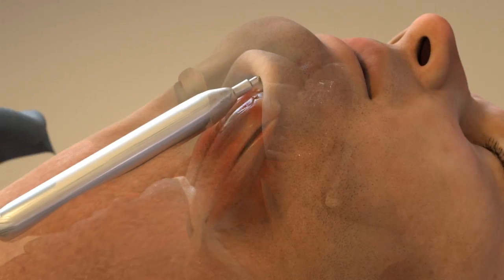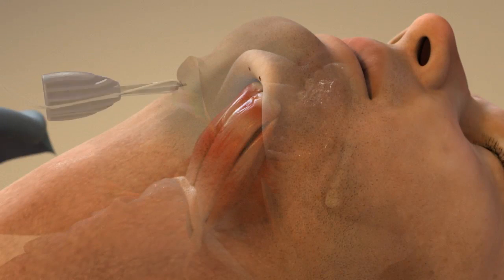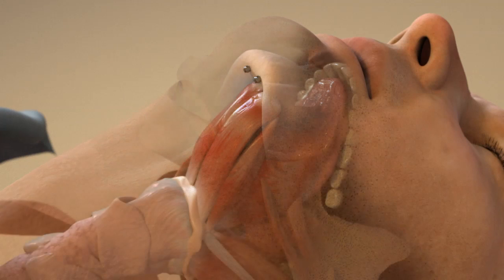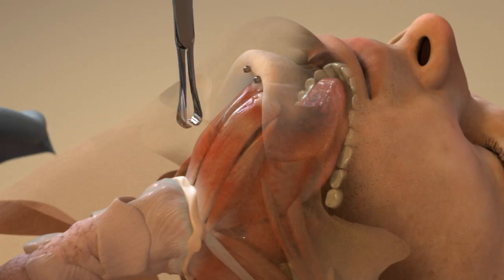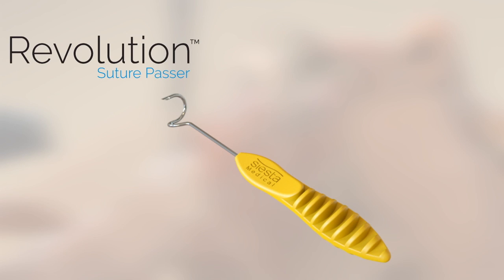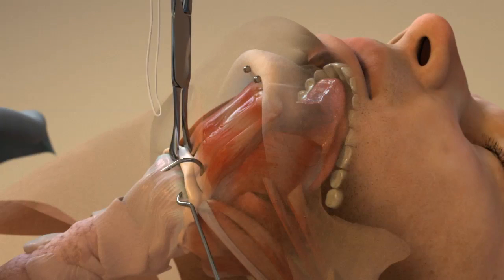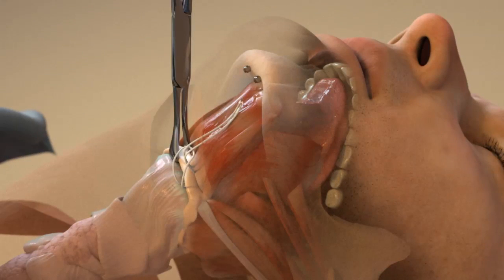Two very small suture anchors are placed under and behind the chin so that they cannot be felt. The hyoid bone is located and a clamp is used to secure it and lift it towards the incision. The revolution suture passer, which simplifies passing suture, is used to place two loops of suture around the hyoid bone. These sutures are then attached with girth hitches and threaded into the suture anchors.